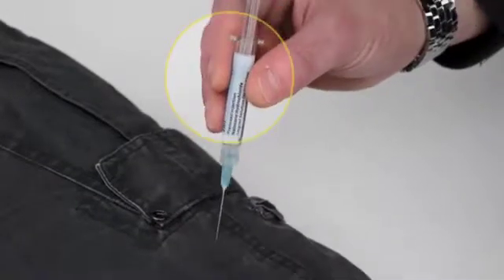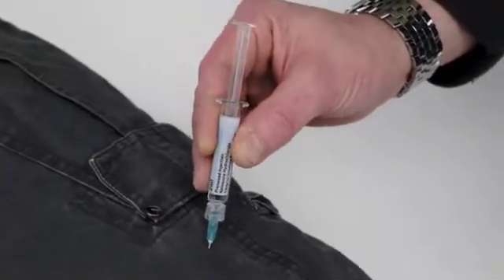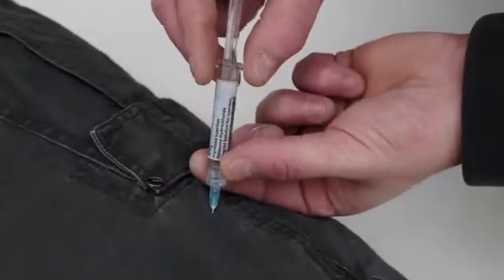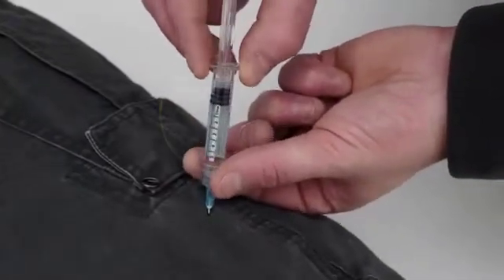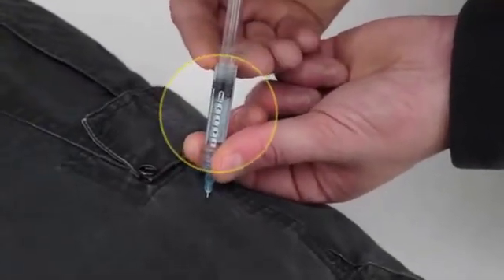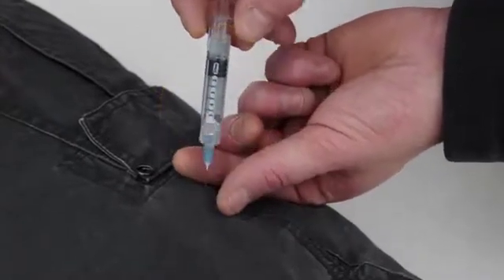Holding the syringe like a pen or a dart, insert the needle at right angles into the outer thigh or upper arm muscle, through clothing if necessary, and inject to the first black line to give a 0.4ml dose.